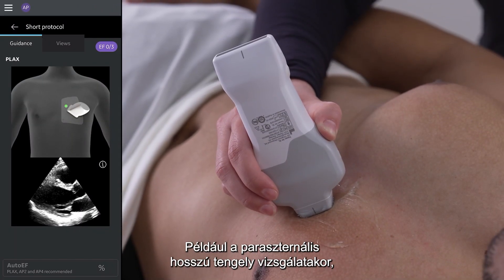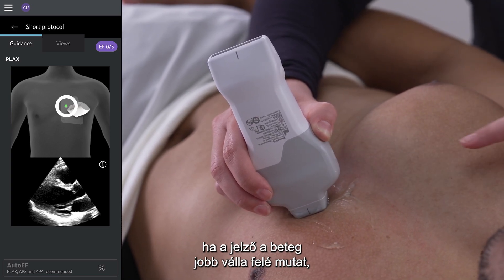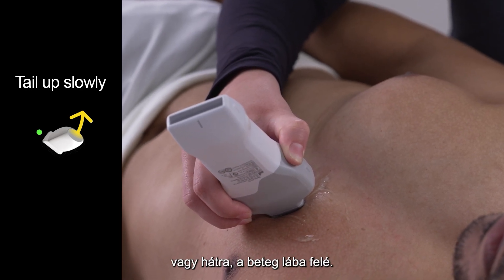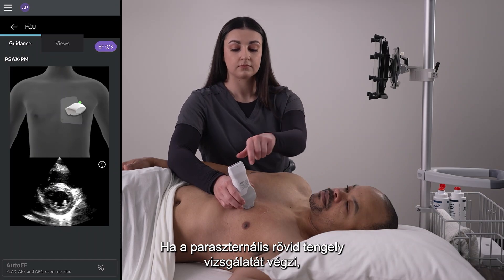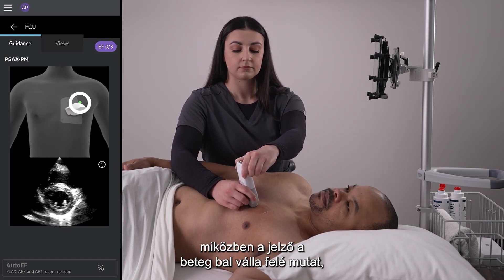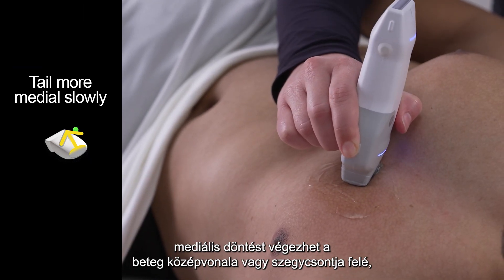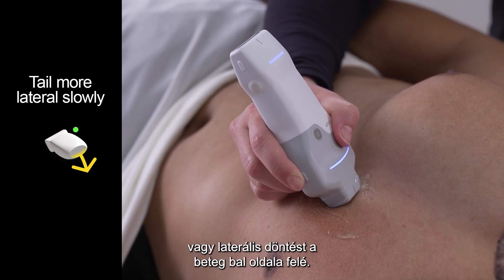For example, when scanning the parasternal long axis with the indicator pointing towards the patient's right shoulder, you can tail up towards the patient's head or tail down towards the patient's feet. If you are scanning the parasternal short axis with the indicator pointing towards the patient's left shoulder, you can tail medial towards the patient's midline or sternum, or tail lateral towards the patient's left side.